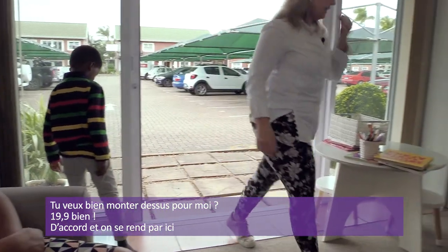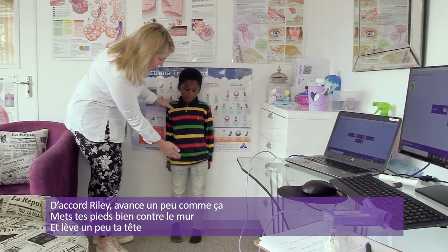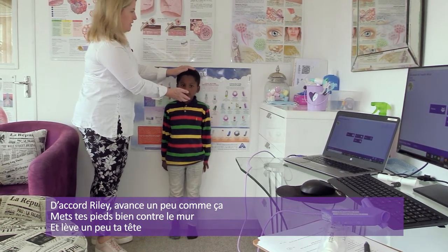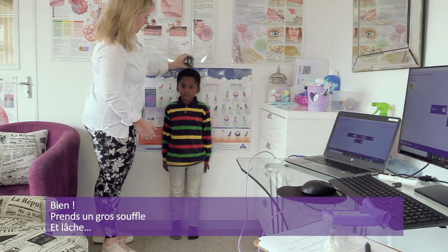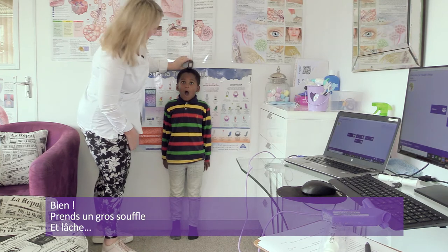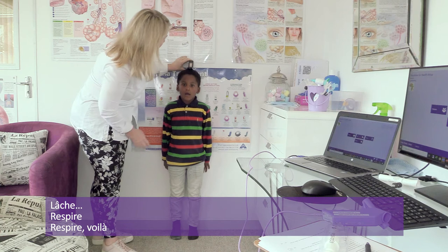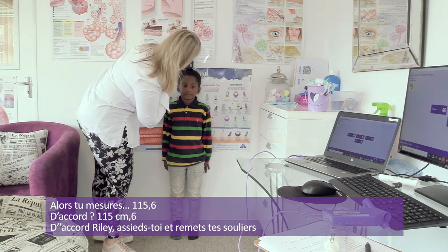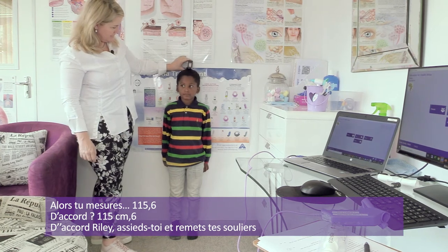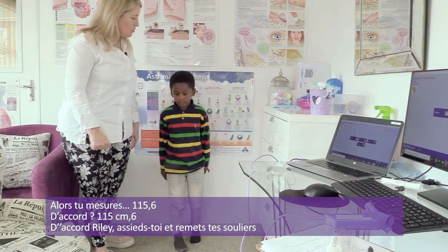19.9, good. Okay, and let's go over here. Okay, Riley, just go a little bit this way. Okay, put your feet flat against the wall. Flat, yes, and make your head, good boy. Okay, so make yourself tall, take a deep breath in. Okay, and relax. Okay, rest, you can breathe. You can breathe, that's it. Okay, so he measures at 115.6. Okay, 115 centimeters, 0.6. All right, you can take a seat and put your shoes on.